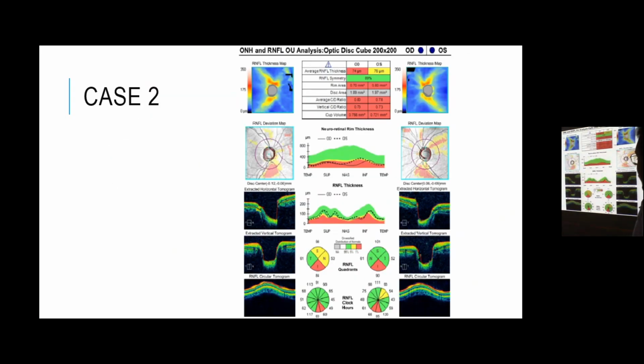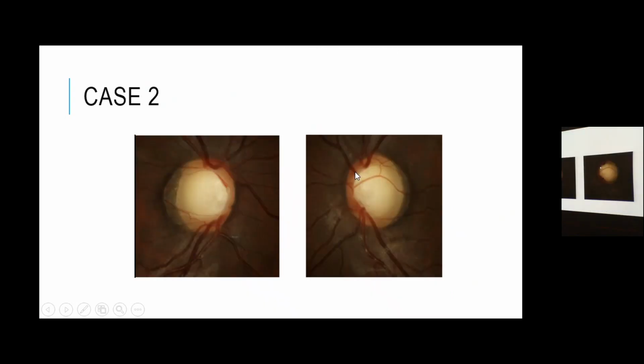Yeah, also here it's measured, scaling 1.9, 0.8. But maybe it's not the same image. Yeah, but this one, the image does look large. It's another reason. If you have a large disc, you can have a large cup.